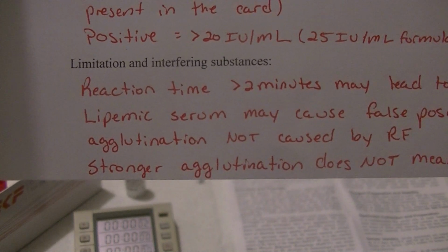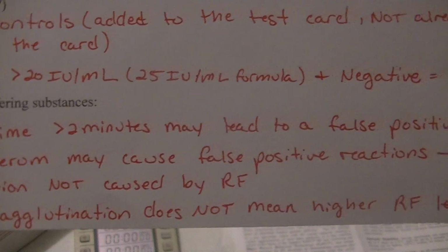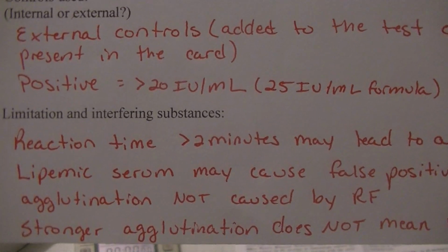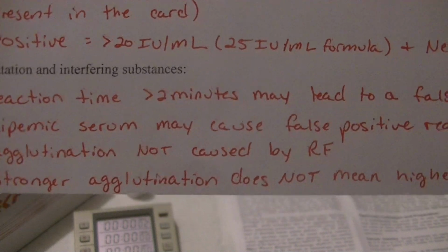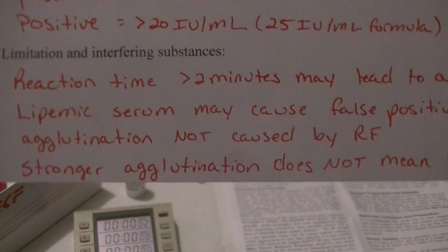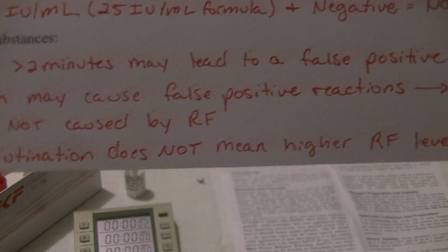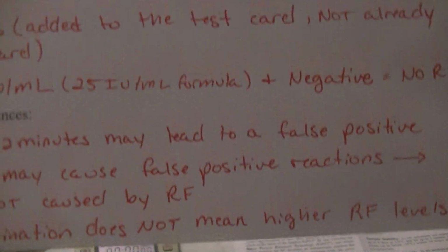Limitations are also listed. The reaction time. If you were to wait longer than 2 minutes and then come back and look for agglutination, you may get a false positive result. That is because the card will start to dry up over time. Lipemic serum may cause false positive reactions because agglutination can happen, but it's not because of a reaction with the actual rheumatoid factor. Stronger agglutination does not necessarily mean higher levels in the qualitative test.